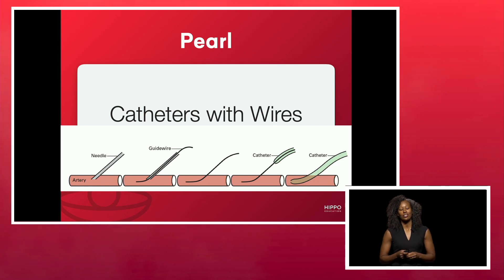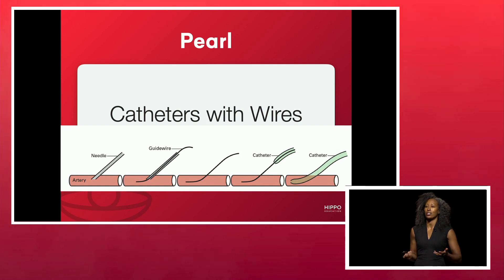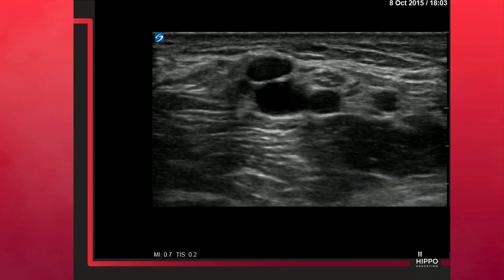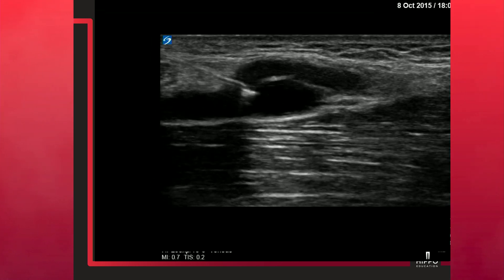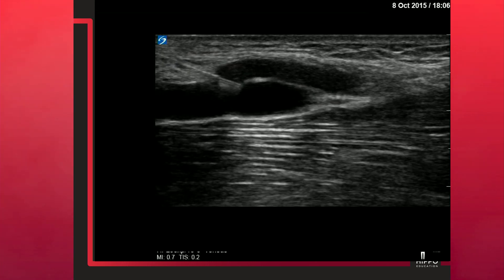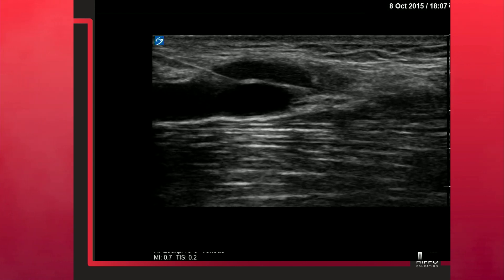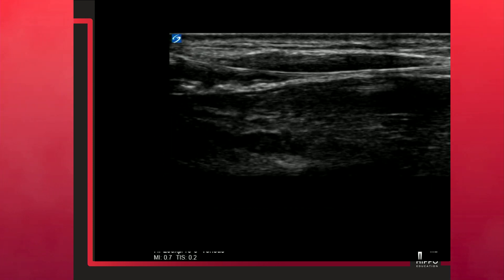Another pearl I love is using a catheter with a wire. Most of the time when you're called as a doc to help with peripheral access, the patient has scar tissue from being punctured multiple times, and you get hung up trying to thread the catheter over that scar tissue. A guide wire gives you a little wiggle room. Here's an example with a vein on top of an artery — going in-plane in long axis, you'll see the needle go through the anterior wall, then thread the wire, watching it travel along the posterior wall so you can navigate any tissue tension.